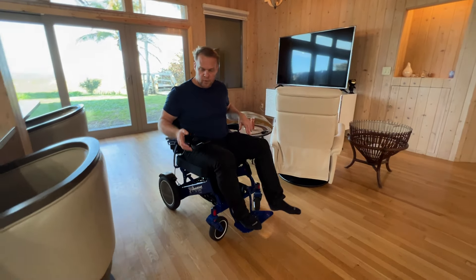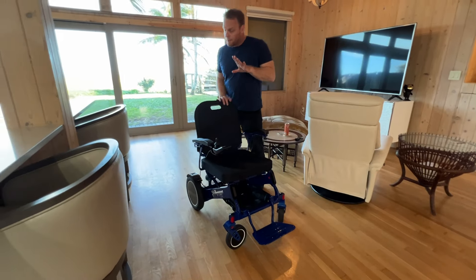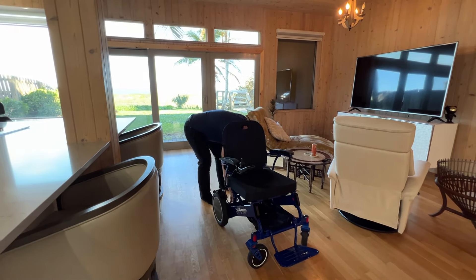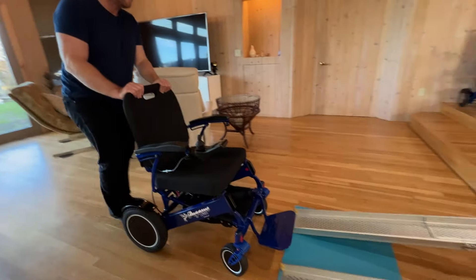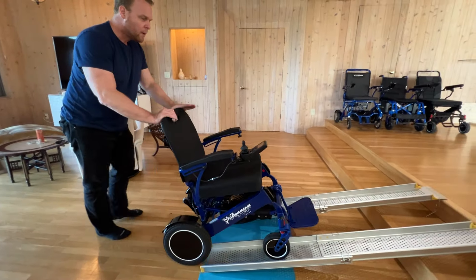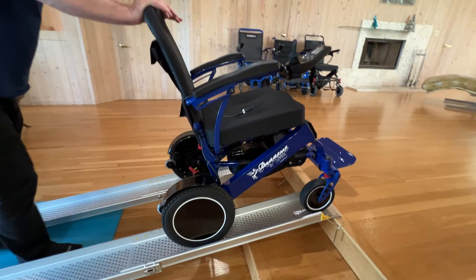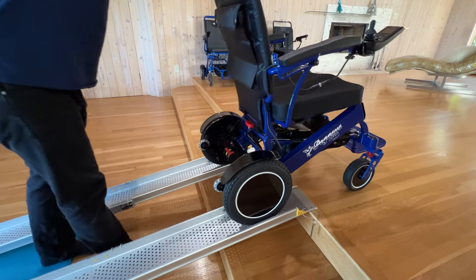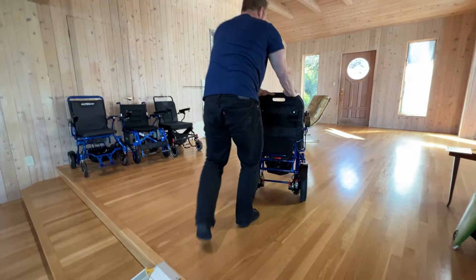So let's see how this chair can be pushed off this ramp. So far, this has just been easy, easy driving — enjoyable. And now, if I had to push this into the back of a pickup truck, for example — look at that, there's no issue at all. It is doing absolutely wonderful.